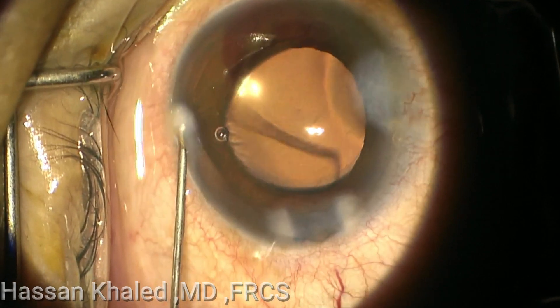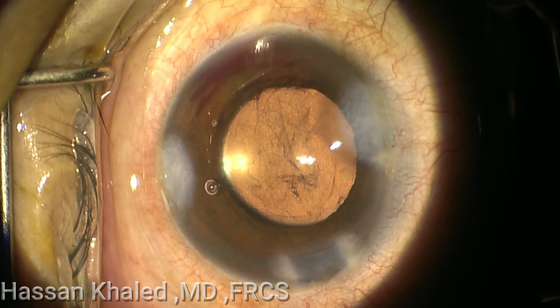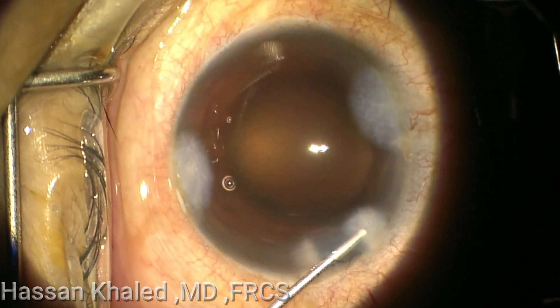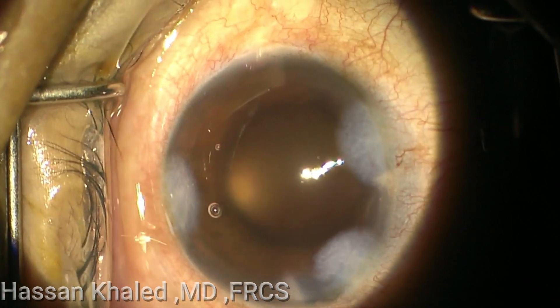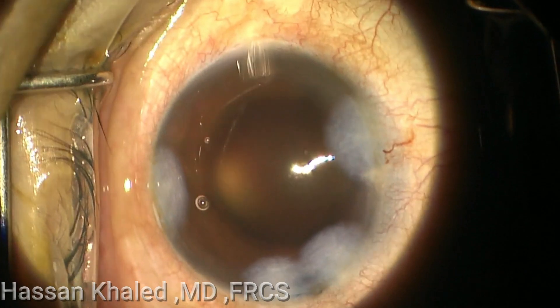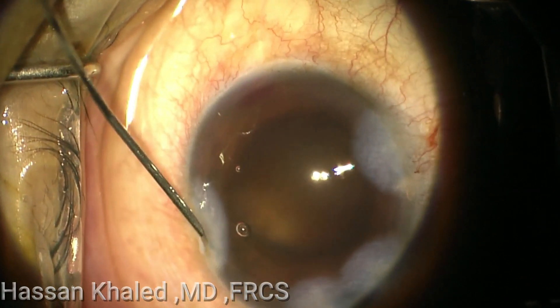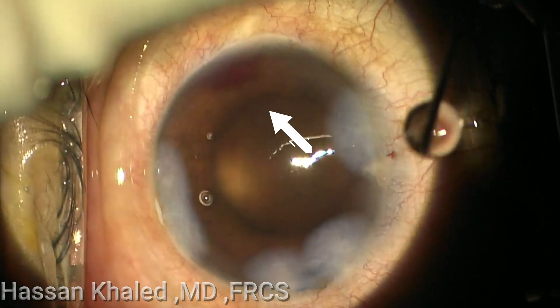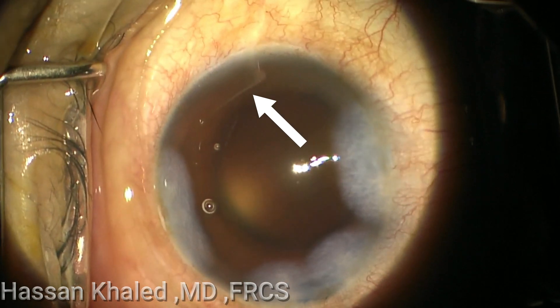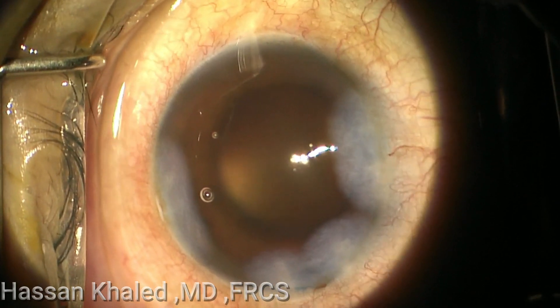Now you can see the bleeding from the angle. You can see now it's clear, and the blood disperses inside the anterior chamber. I complete stromal hydration for the paracentesis and also for the main incision, trying to increase the intraocular pressure. You can see now the bleeding at the white arrow. So now, what is the next step to deal with this condition?